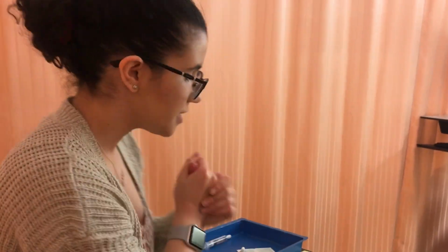Hi, I'm Ashley Amaral. Today I will be demonstrating how to do a chest tube dressing change as well as give heparin via continuous infusion. So I'm going to start with some hand hygiene. My patient's in a good position right now. She's in semi-Fowler, so we can go ahead and get started.